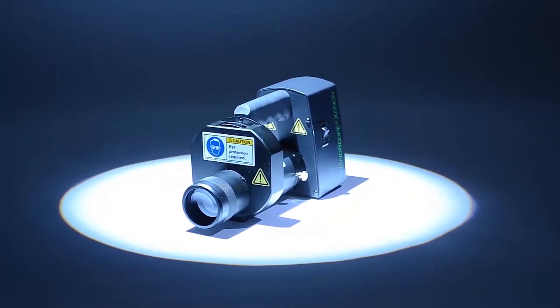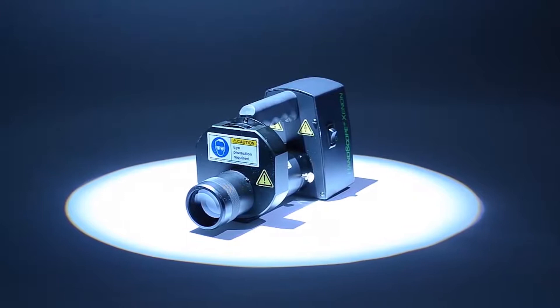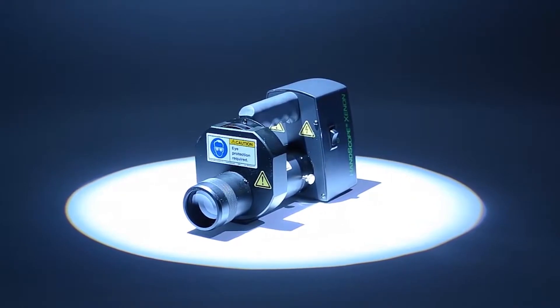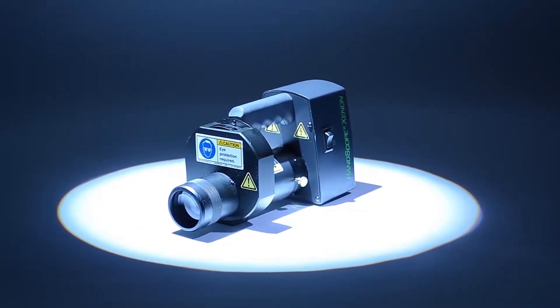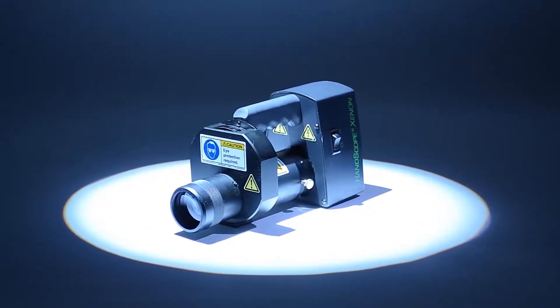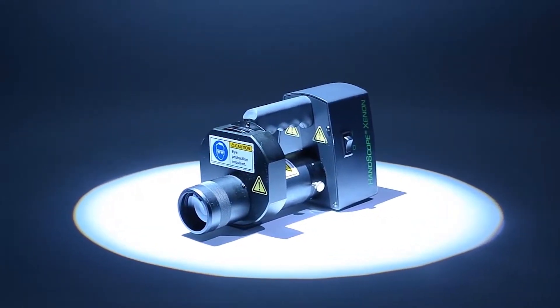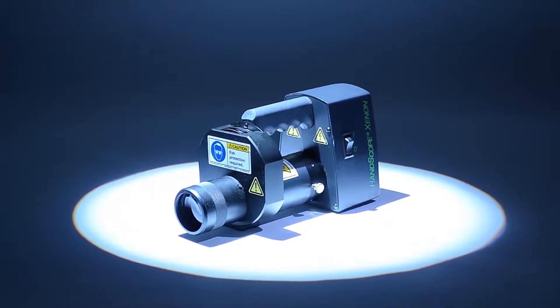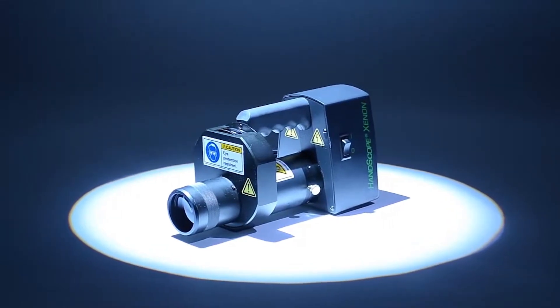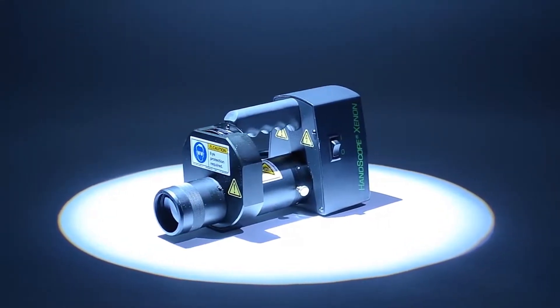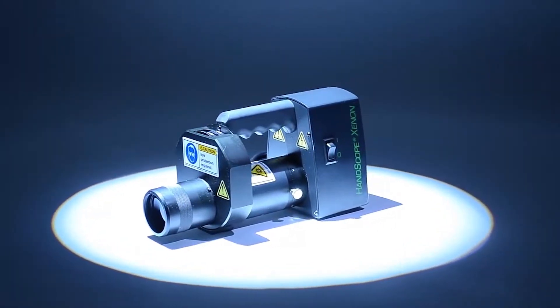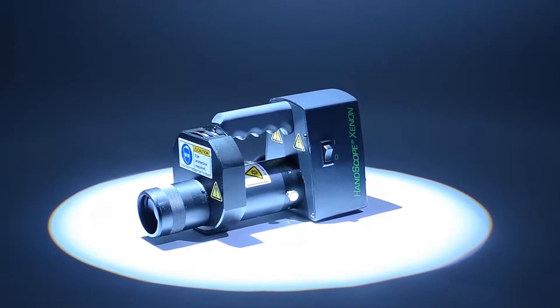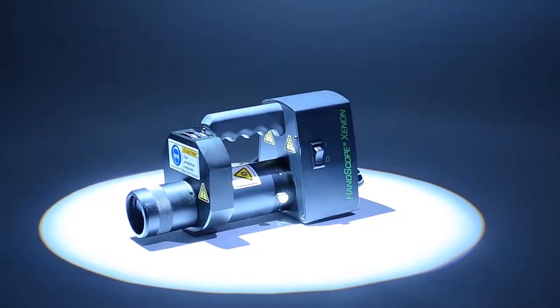Mahanscope Xenon is the only battery-powered forensic light source, allowing true one-hand operation. That is, the ability to direct and select the wavelength of light with one hand.